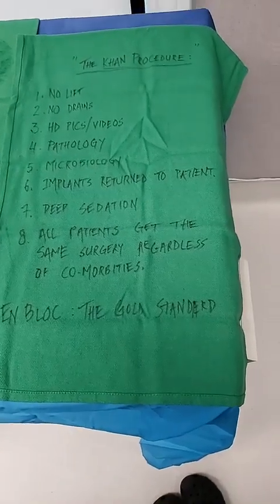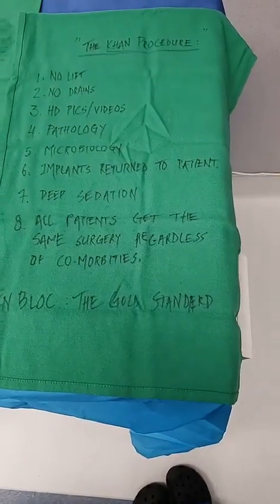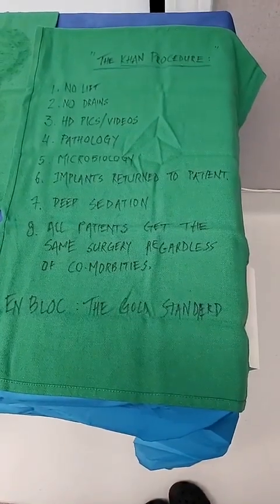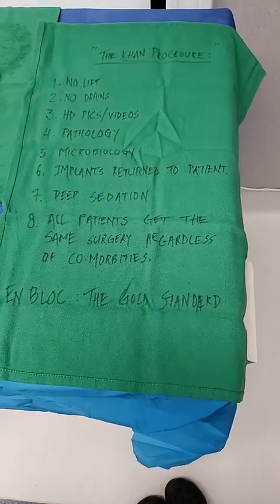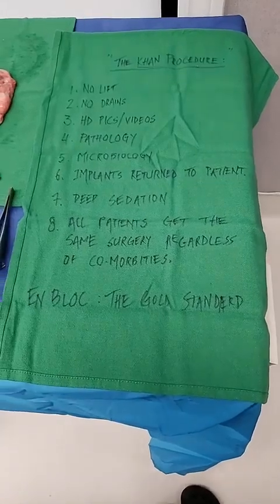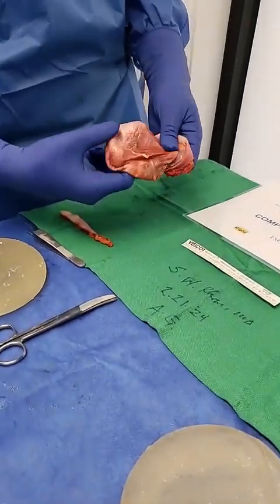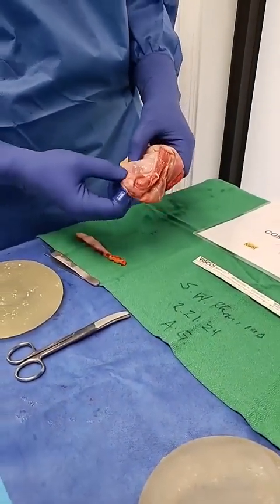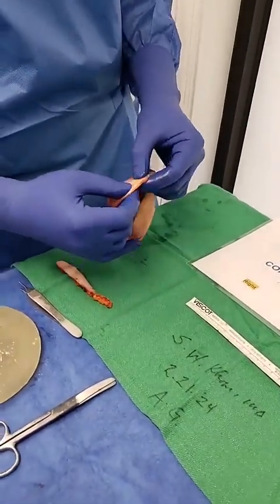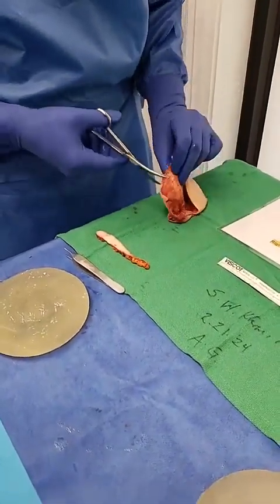So what I'm looking for essentially is, you know, these implants are essentially disintegrating. The 300 tag, I'm going to look for it real quick and see if I can find it. The entire implant capsule has been removed, so whatever badness, look how it's weeping, literally. It's like crying. So if I go in over here, I've gone in, looked. I'm going to go right in the center with the same pair of scissors. Remember, this is hard.